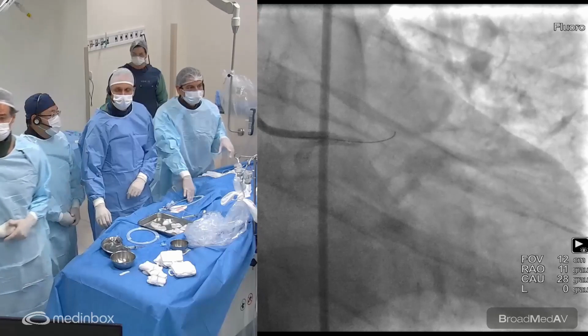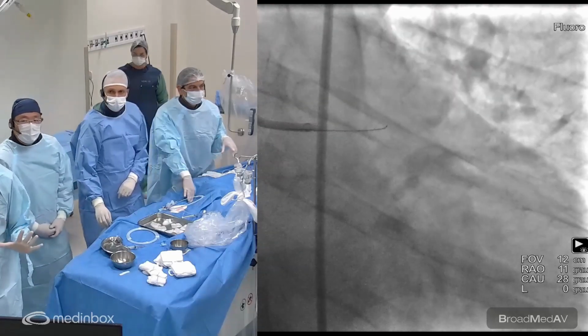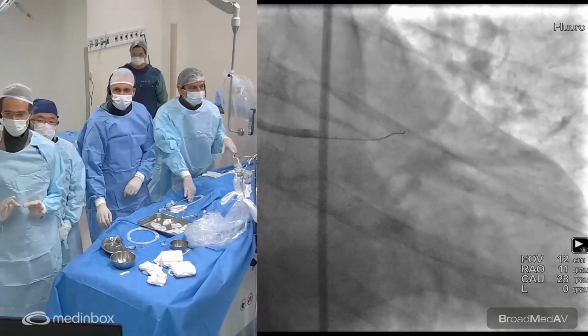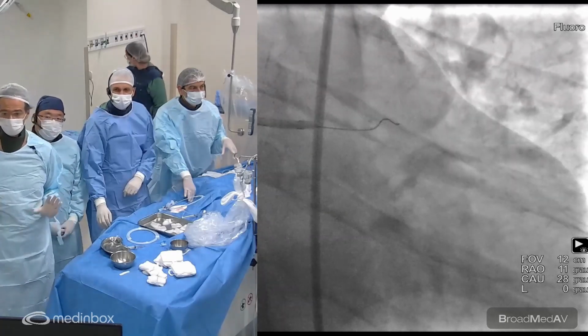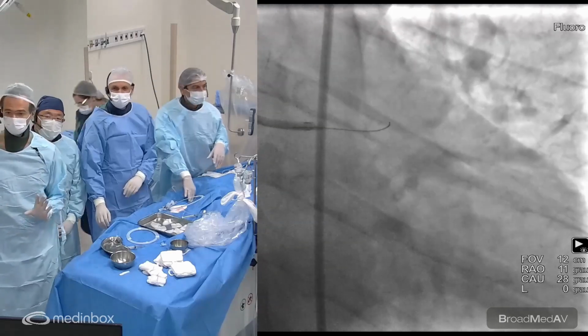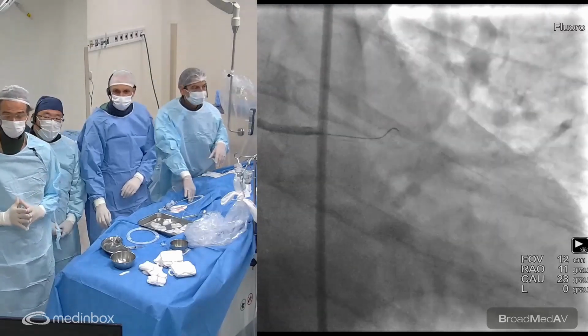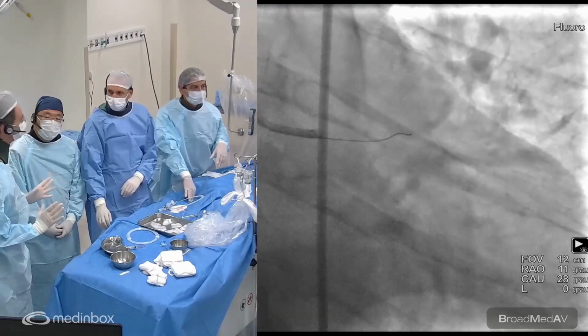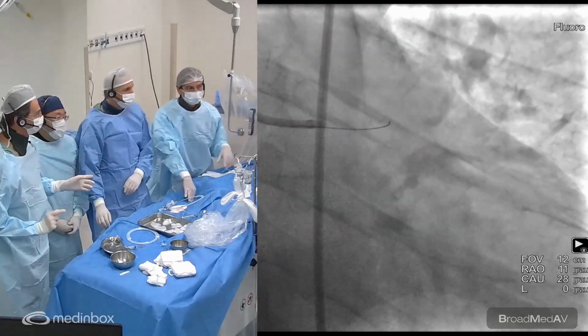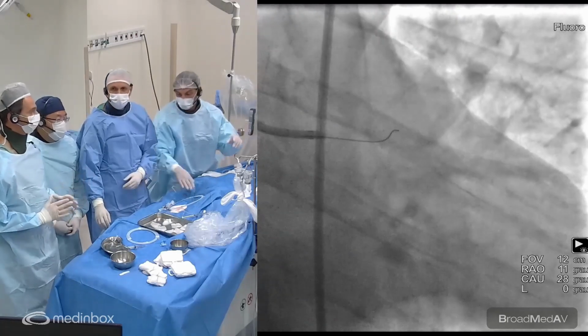So now you have the wiring there. That's perfect. So you can see the bend now. And then you're trying to go through the total occlusion. It's time to stop. Yeah. Yes, because I don't know if we are in the true lumen. Is that correct, Ricardo? Exactly. So there is resistance. What should we do now? Go to another view? Another view. Okay, another view.